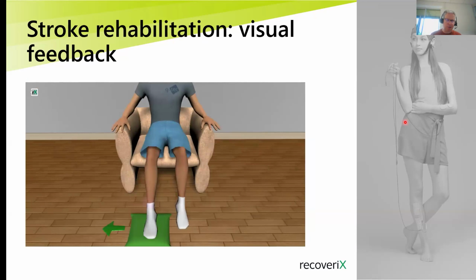If you rehabilitate the lower extremities, it looks like this. It's like you could imagine you would look into a mirror. You're sitting in front of a mirror, seeing your legs and your hands. And the command is again to move the affected leg that you want to train, but also the opposite side hand. So we always do one part of the left side of the body versus one part of the right side of the body. So to rehabilitate the right leg, of course, the view is just flipped, so you would move the right leg instead of the left leg, as is here.